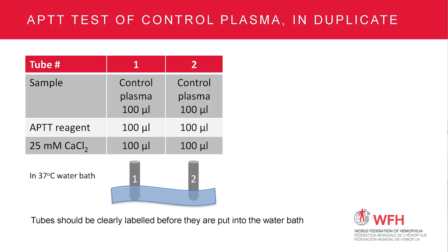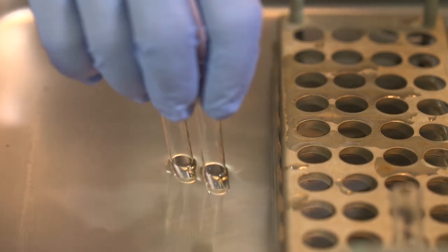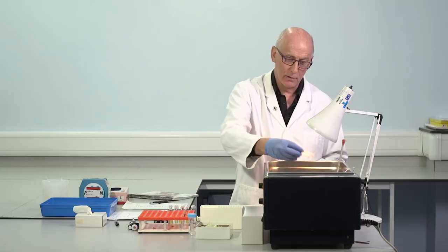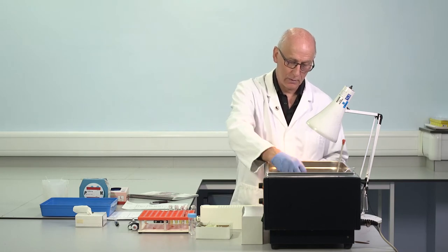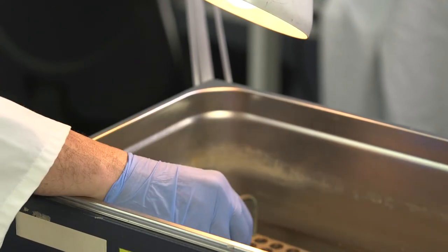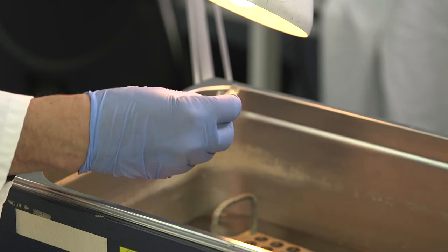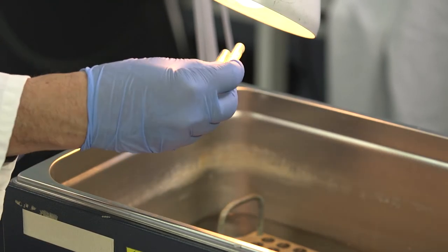So both tubes now contain calcium. The activation, the clotting process is proceeding. And we're tilting the test tubes, which we'll talk about in a moment. And we're using visual observation to look for a clot formation. I'm just going to record the clot and then we'll come back and talk a little bit more about this.